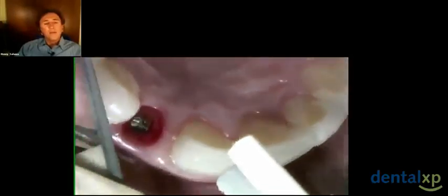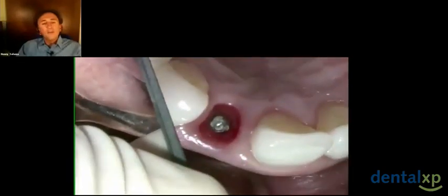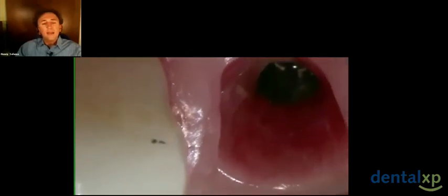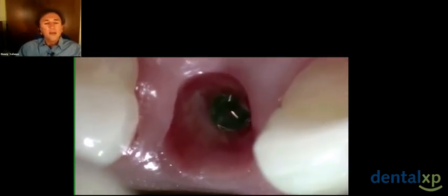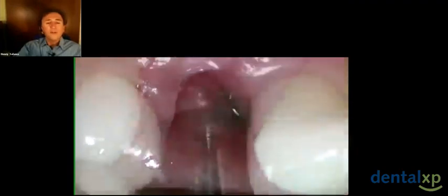And we've removed the temporary abutment, and we can really look into that zone. We have very thick tissue, as you can see on the labial, that we've been able to maintain, and very healthy environment, very, very healthy soft tissue environment inside that sulcus, which becomes really a very critical component to maintaining tissue health.